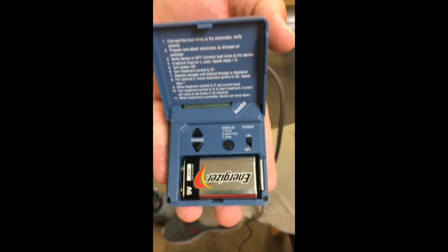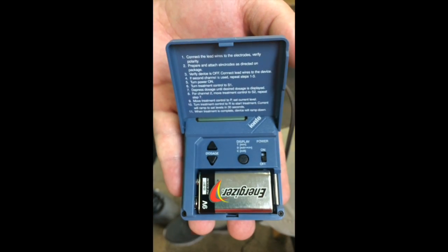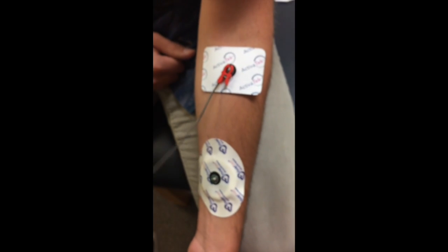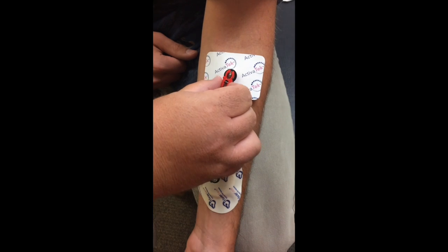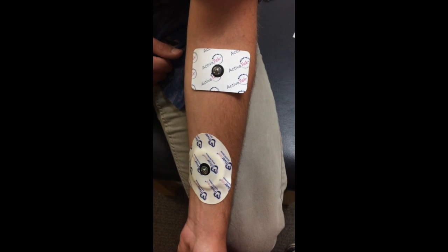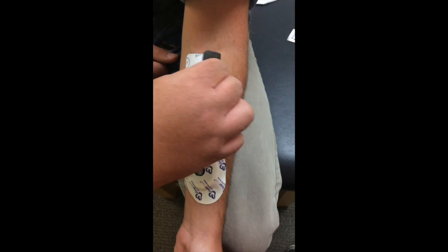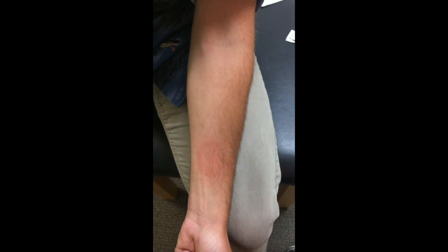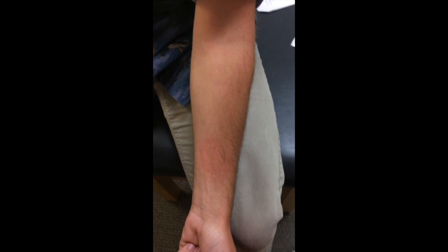When the treatment is over, make sure to turn the machine off, and then we will disconnect these. Then we'll take the pads off and check the patient for any adverse effects, any rashes or anything on the skin. Ask them how it felt, and if we need to change something for next time.